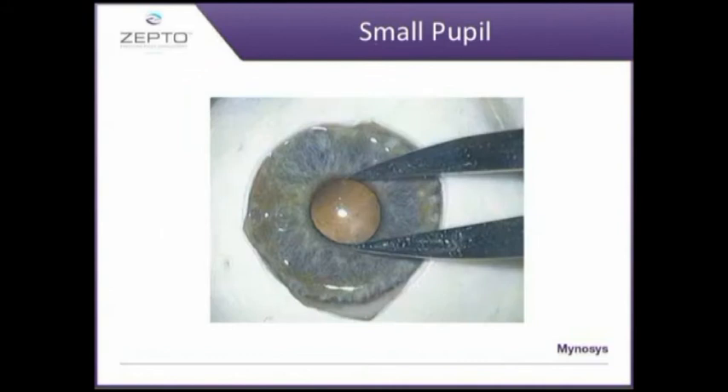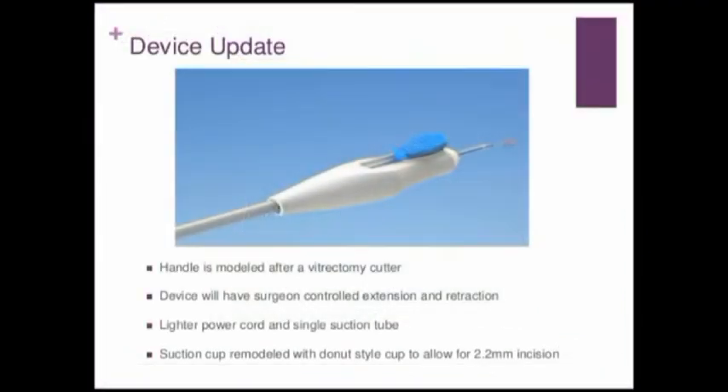Another advantage of this device is that it can also be used in cases of small pupils, because the device is flexible and can actually be placed under the pupillary edge. This is the handpiece, which is modeled on a vitrectomy handpiece. It has a mechanism that allows retraction and extension, and it can be inserted through a 2.2 mm incision.